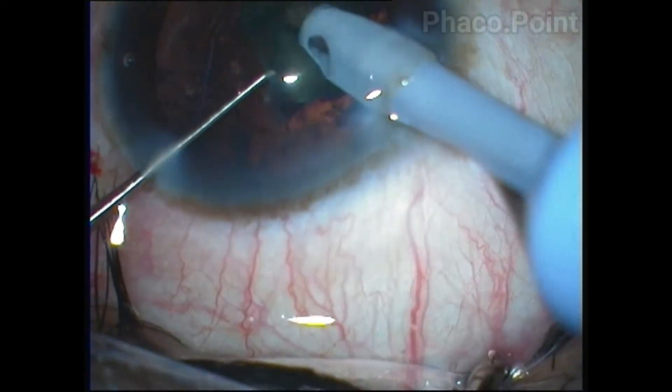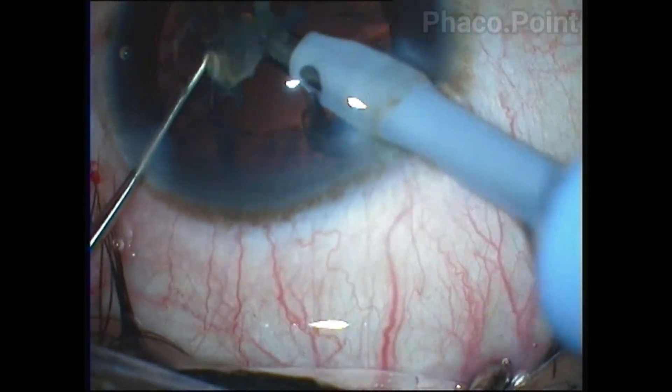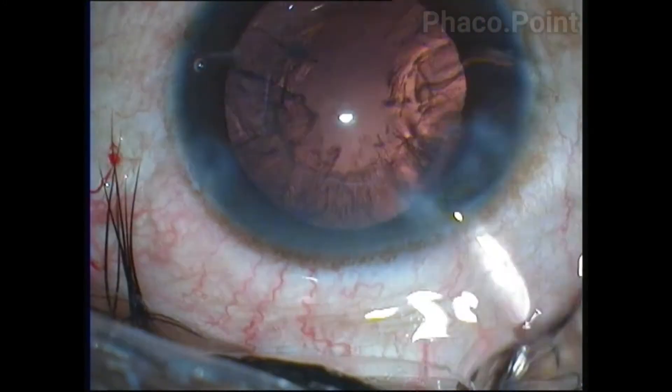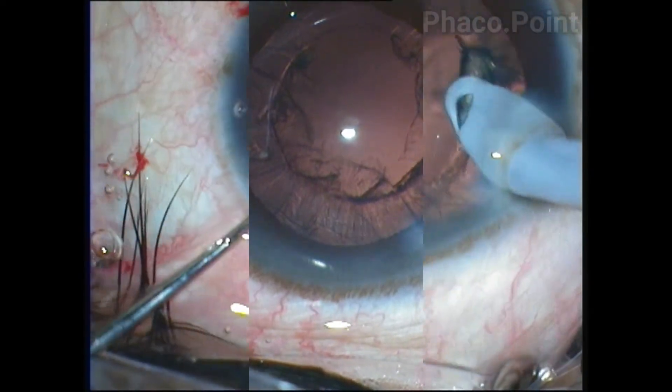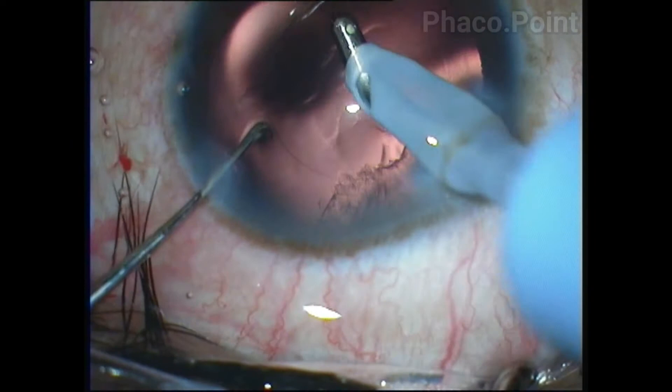The nucleus disassembly is carried out by a direct chop technique, and once this has been successfully accomplished the cortical aspiration is performed using a unimanual or coaxial IA cannula.